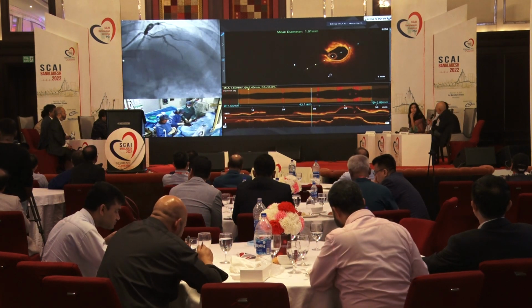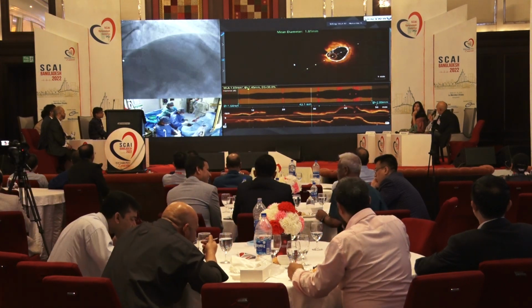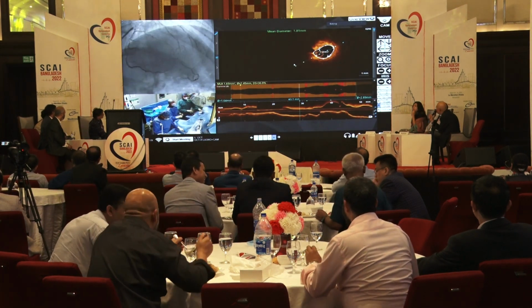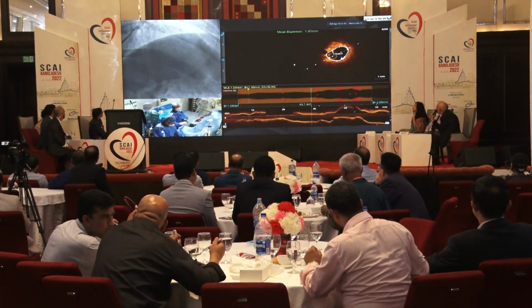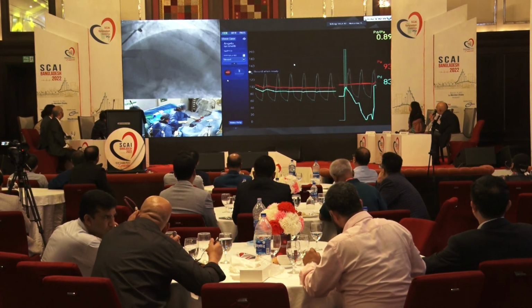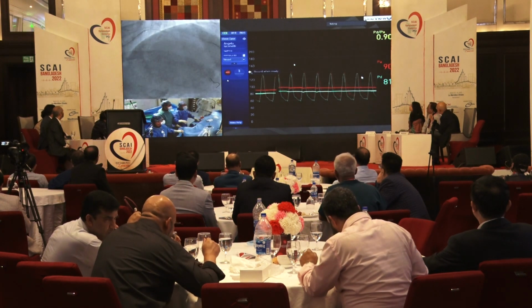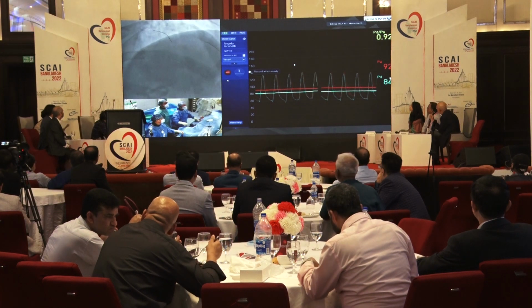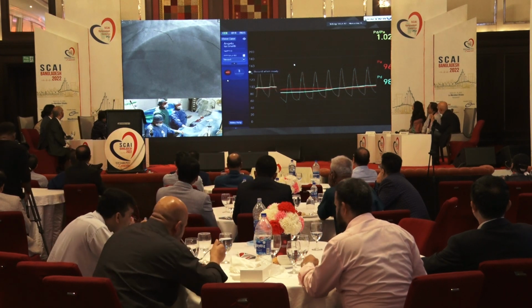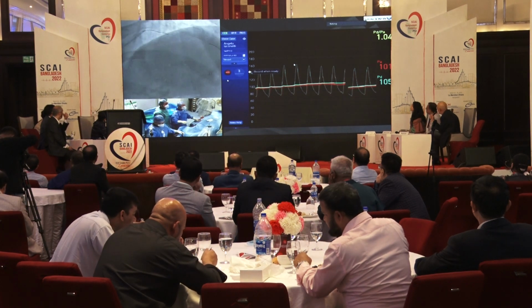I like the pressure wire. Yes. Can we go back on the screen of the pressure wire? Let me go with the pressure wire in the diagonal. Okay, here we are in the left main, in the proximal LAD. Just to double check that the calibration is okay. So it's 1, which is okay. Now we go in.